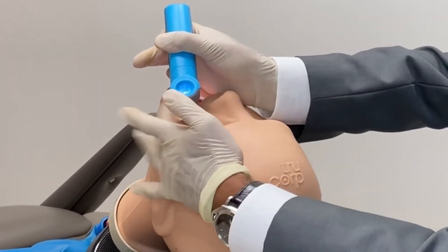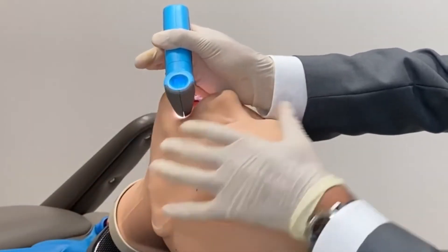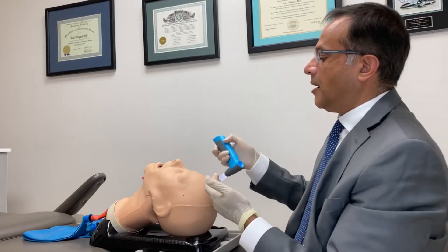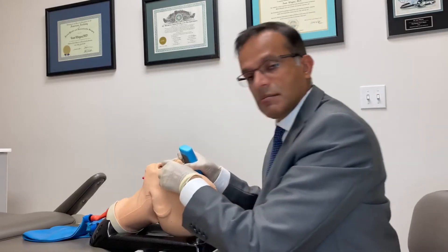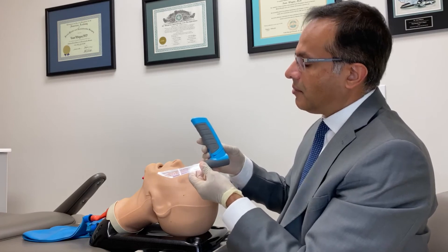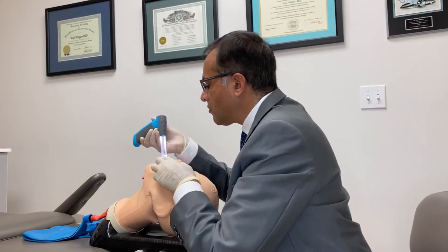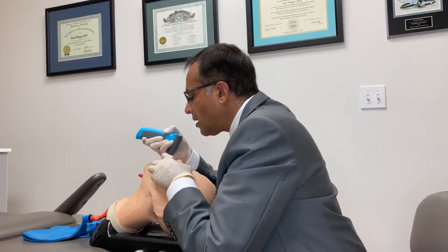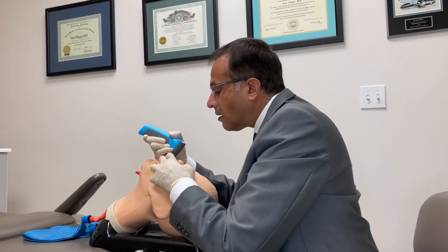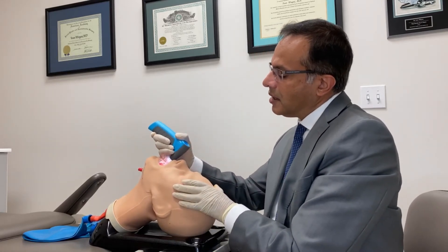The teeth are here and the device is sitting on the side — this can be either left or right. You just need to do what's necessary to gain access to the airway once you assess the state of the teeth. That's one key benefit of the v-scope. The other is intentional pressure: place the v-scope underneath the epiglottis with that rubber on the teeth and gently lift up.